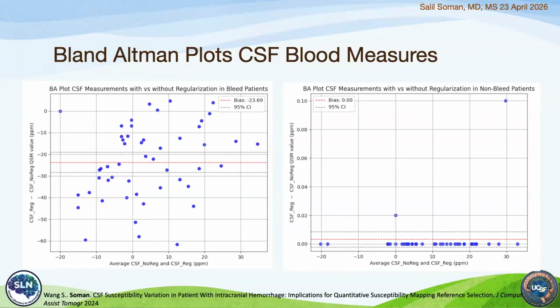So for this in my lab back in Boston, the best that we could do was to say, okay, the idea of FLAIR is that it is a T2 image where you're suppressing CSF, right? So if there's anything abnormal in the CSF, it won't suppress. So we used that as our metric, and we had 1 millimeter isotropic FLAIRs, so they were pretty good. But you're right, the CSF will probably be more sensitive. So that would be even better evidence for this one way or the other. Yeah, that would be cool actually. Anyway, we can talk about it later if you want.